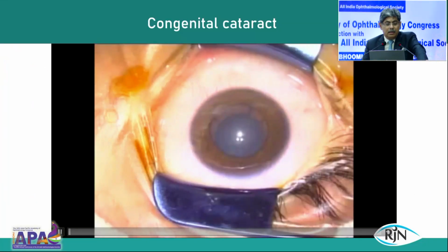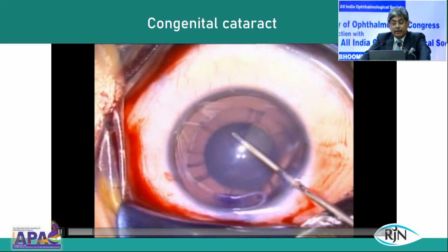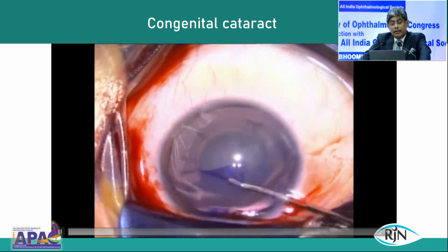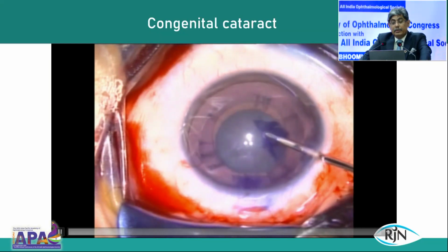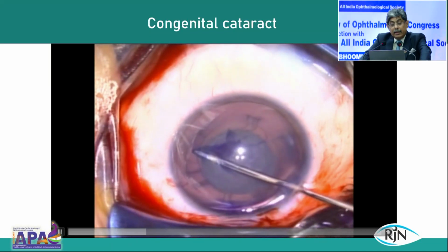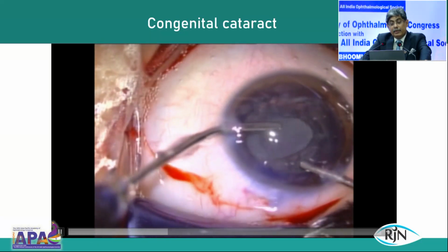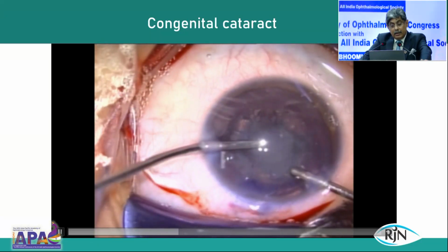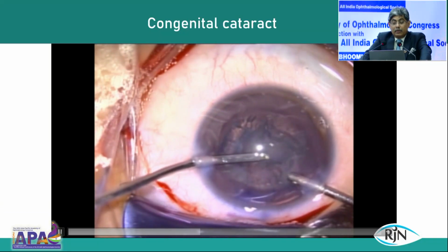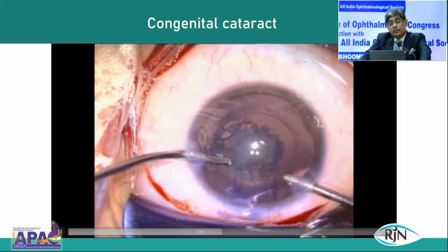This is pediatric cataract surgery, which is slightly different from adult cataract, because the anterior capsule is more elastic, so there is a high tendency for extension of the capsulorhexis to the periphery. Secondly, to prevent it, we have to fill the chamber with viscoelastic, and the viscoat is much better, or as Dr. Khokhar says, we should use the Healon to do this cataract.